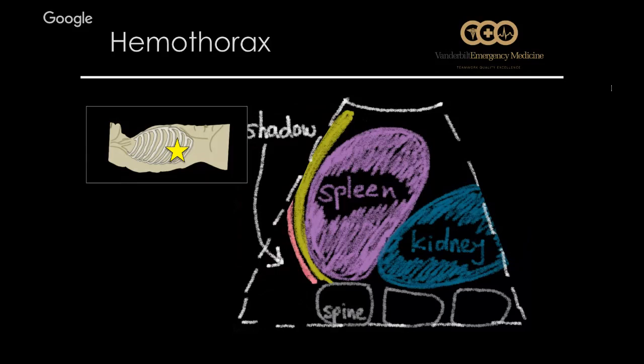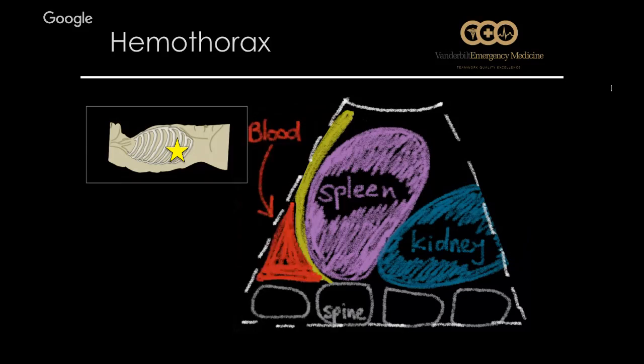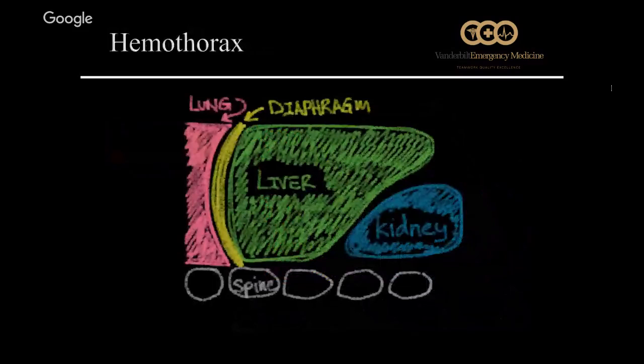Whereas if there's fluid in the chest, next slide, now I'll be able to see the spine past the diaphragm, and we call that a positive spine sign. And that's an indicator that there is fluid in the chest. Next slide. And once you do this a few times, it takes a little bit of imagination at first, but it becomes really obvious and a very easily acquired skill. Next slide.